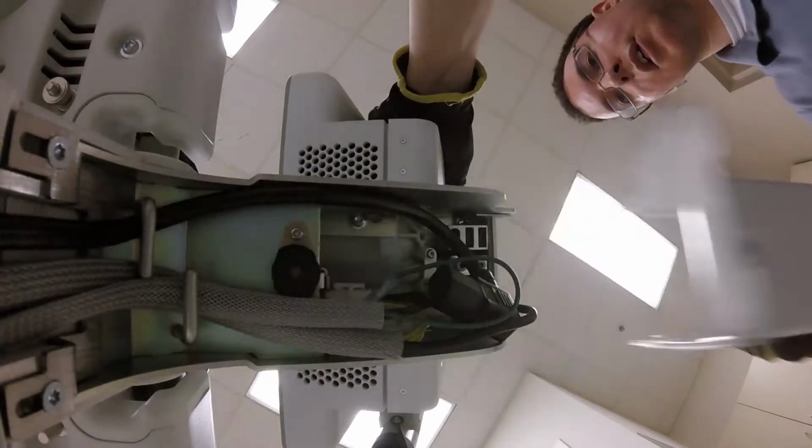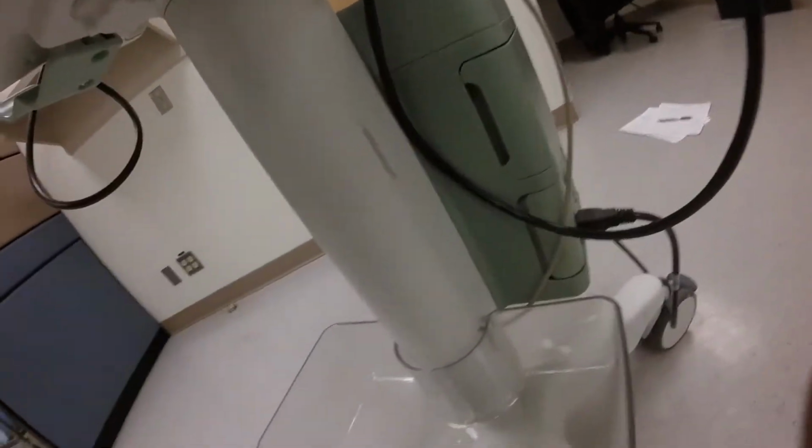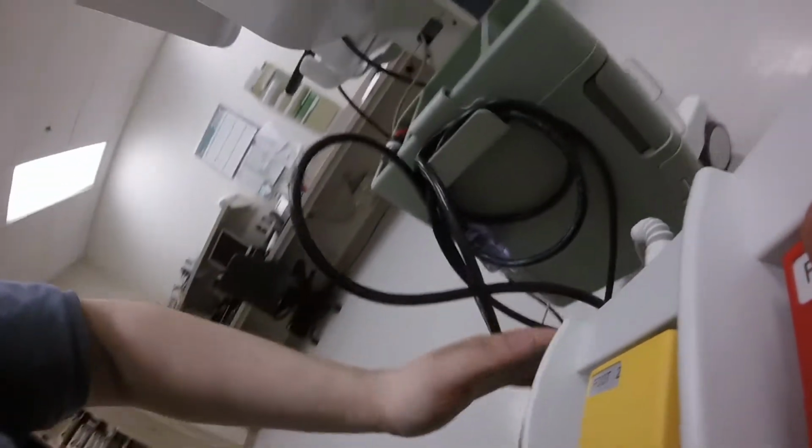And then we want to make sure that there's no loose connections in the bottom of the machine. Also, we're going to route the foot pedal into one of the USB ports at the bottom. There's a set of foot pedals to operate the machine in case your hands are busy. But there are also USB ports at the front of the machine. I did install the basket at the bottom and the power cord, and it's a little bit tangled.